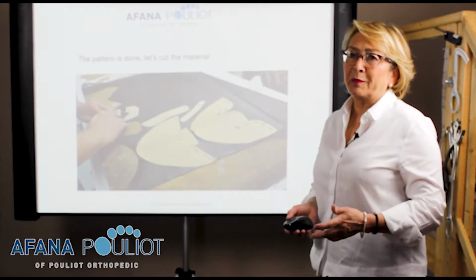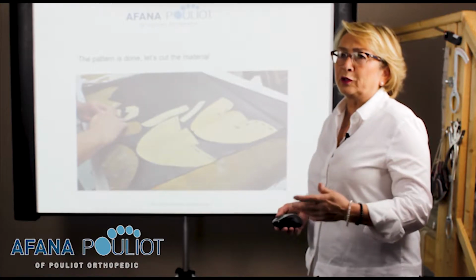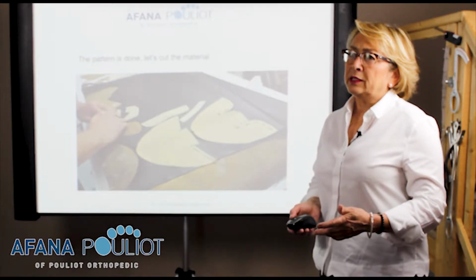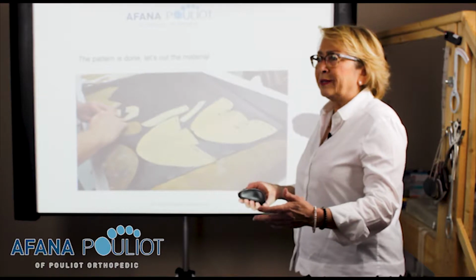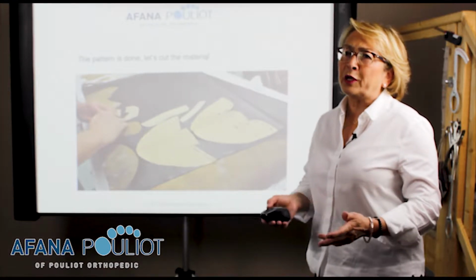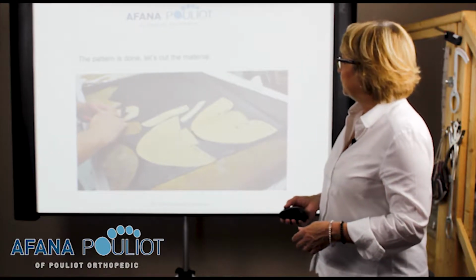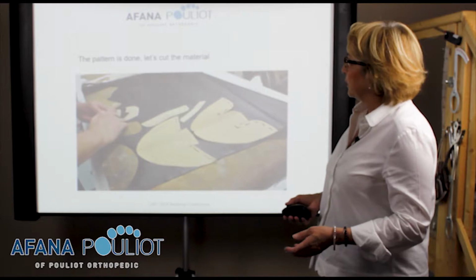Once again, this is custom made. So there is a catalog available on our website that will give you some examples of what we could do. We strongly advise that you recommend to your patients what is best for them. For example, if you have a patient with severe bunions, it is nice to have a shoe with stitching and multiple pieces, but you know as a professional that one thing to avoid at all costs with bunions is stitching. So do recommend that your patient choose a shoe pattern that will avoid the particularity of the needs of his foot. So as you see, we cut each piece of the pattern on the leather chosen by the patient.